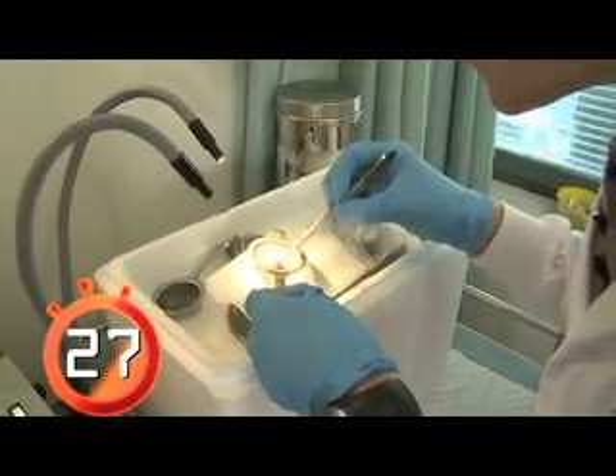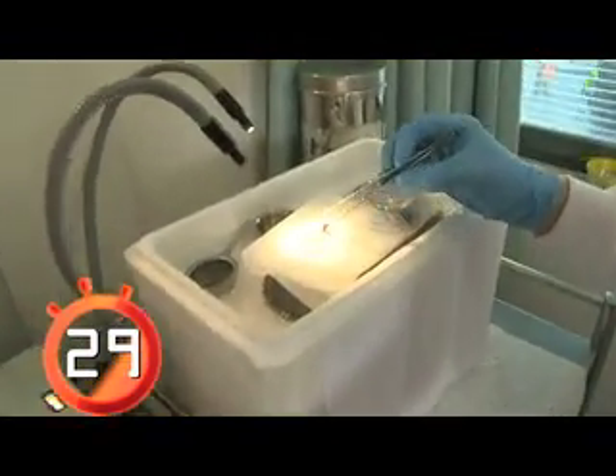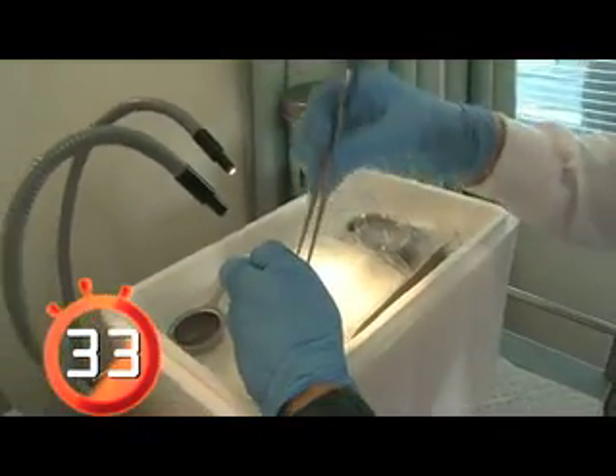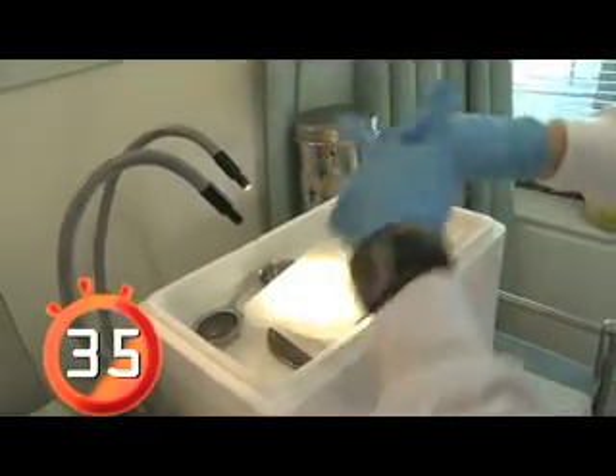So a nice skeletal muscle biopsy sample of around 100 milligrams.